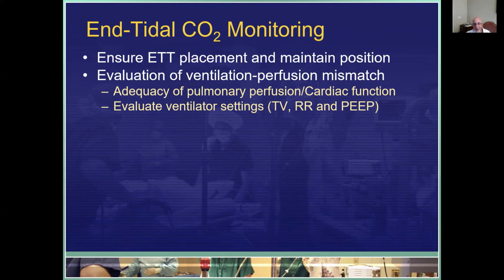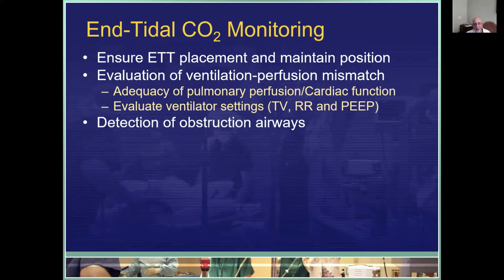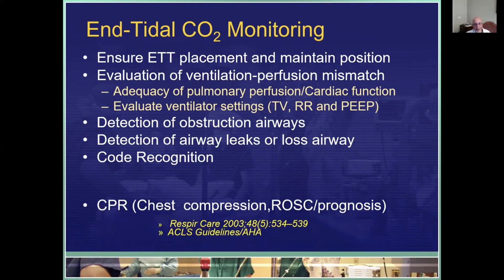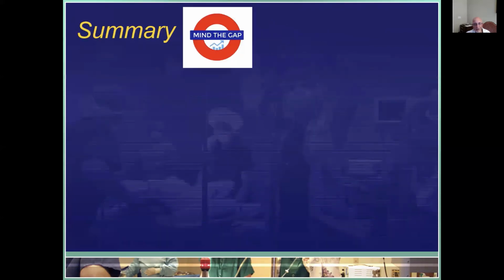It helps you assess the ventilator settings, including tidal volume and PEEP. It also helps you detect obstructed airways, airway leakage or loss of an airway, and recognition of code blue in the ICU, as well as help you perform adequate CPR and detect return of spontaneous circulation.